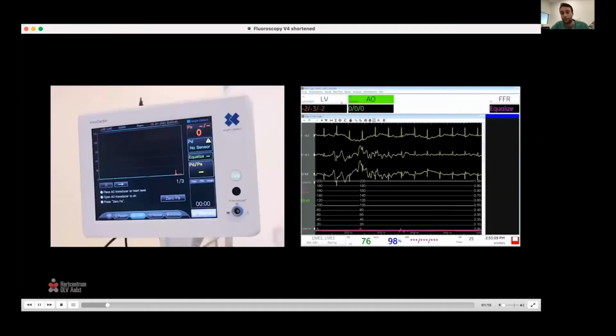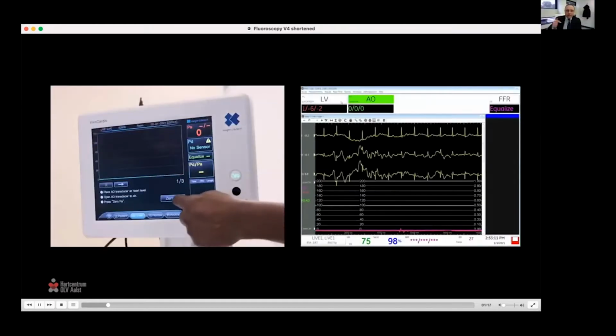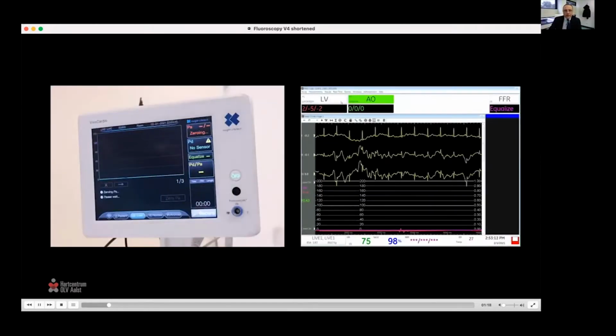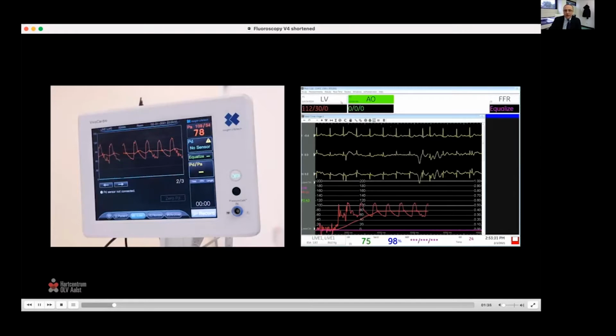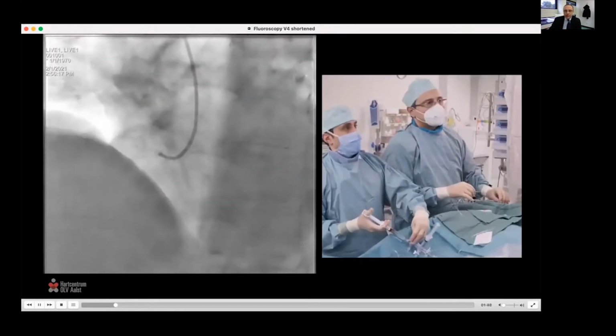Do you want to go on, Emanuele? Thank you very much. And that's the way it starts, as usually. There is a calibration phase where we make the Vivo Cardio console speak the same language of the MACLAB console. So once the aortic pressure is calibrated, we open up the fluid fill connector and we get synchronous measurement of the aortic pressure.